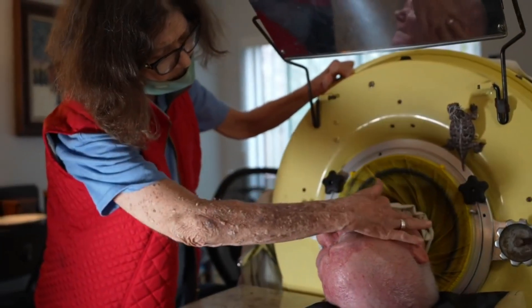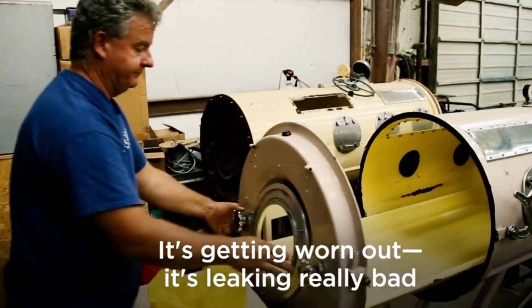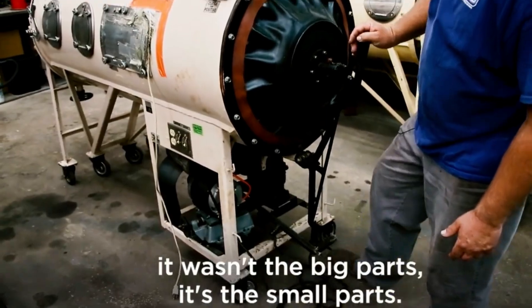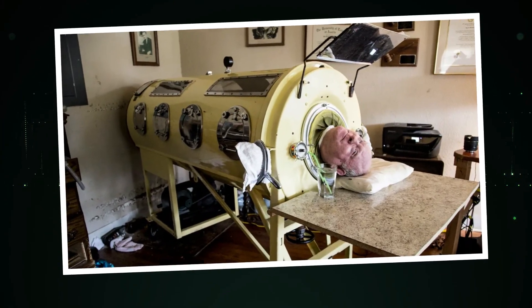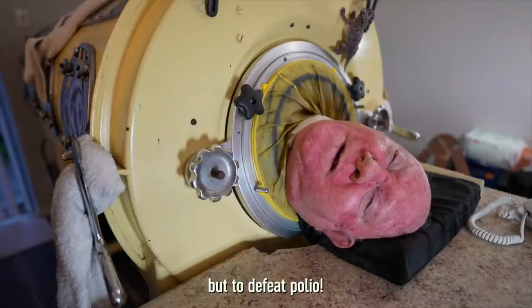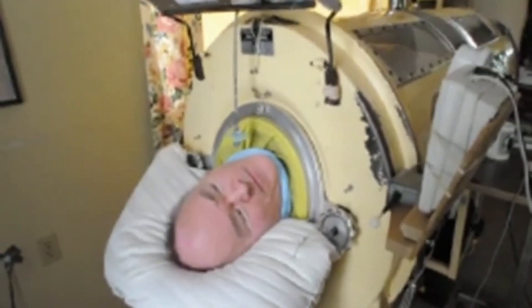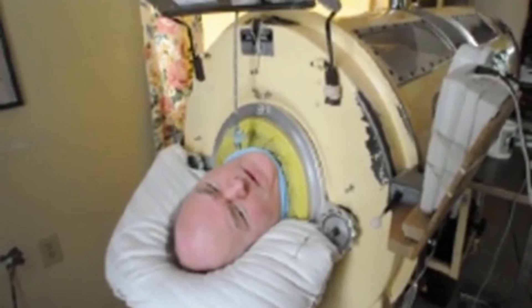However, iron lungs were also very large and cumbersome and required a lot of maintenance. As more effective respiratory treatments, such as positive pressure ventilators, were developed, the use of iron lungs declined. Today, they are largely obsolete, but they remain an important historical reminder of the challenges that were faced during the polio epidemics of the past.